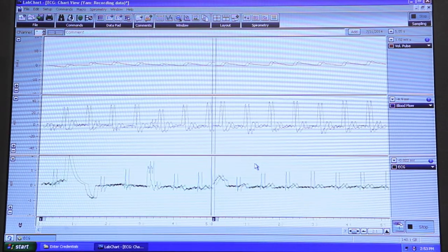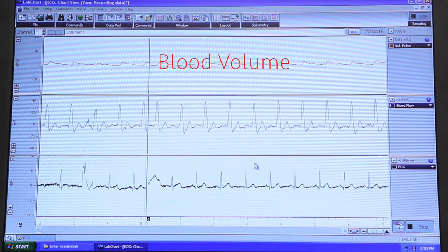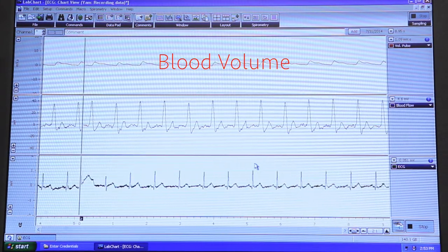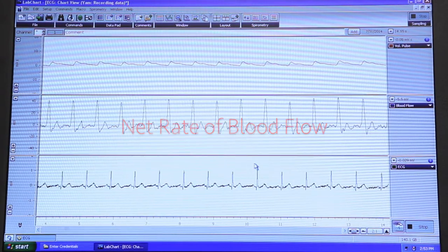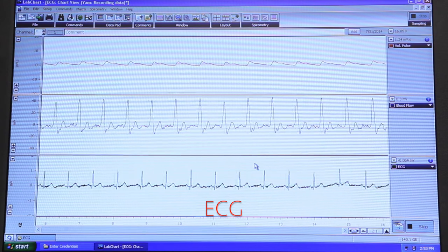The graphs that you see from top to bottom are the following. Channel 1 shows blood volume in the finger over time. Channel 2 shows the net rate of blood flow in the finger over time. And channel 3 is the ECG.